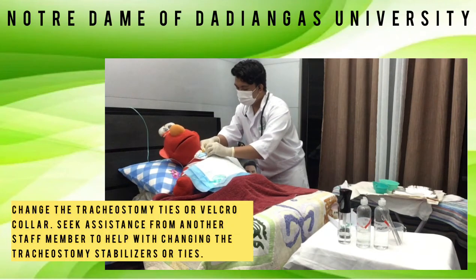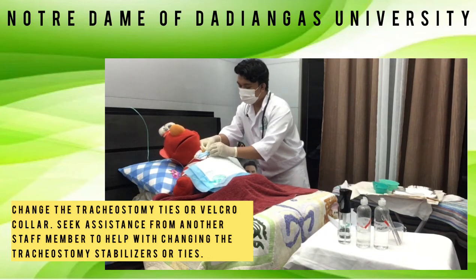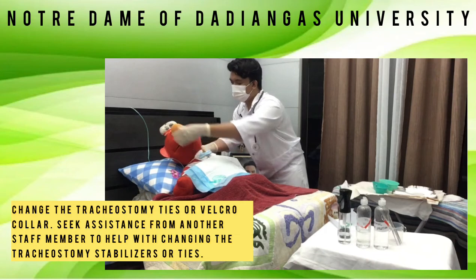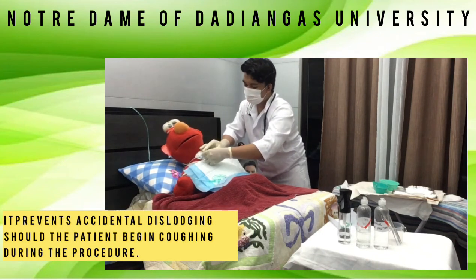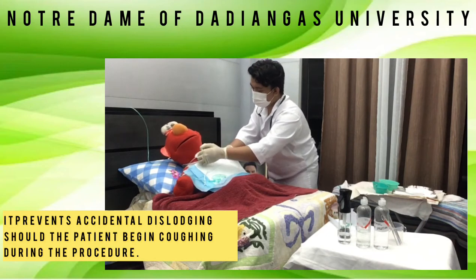Change the tracheostomy ties or Velcro collar. Seek assistance from another staff member to help with changing the tracheostomy stabilizers or ties. It prevents accidental dislodging should the patient begin coughing during the procedure.